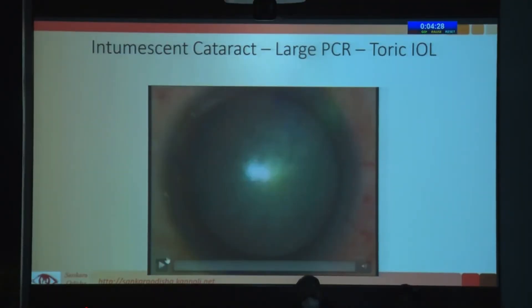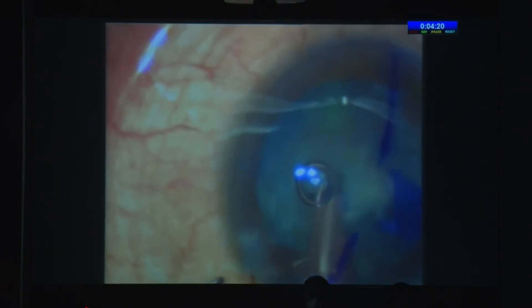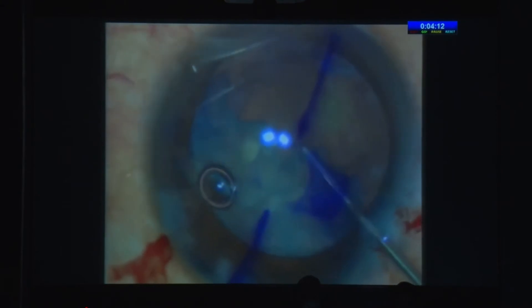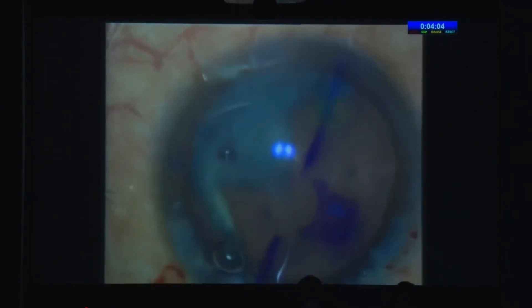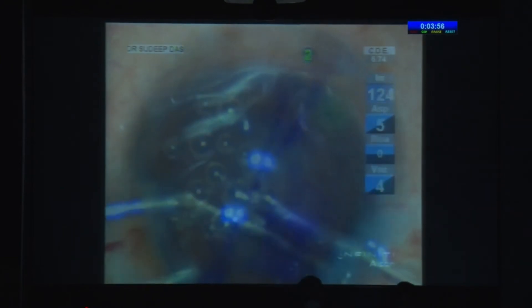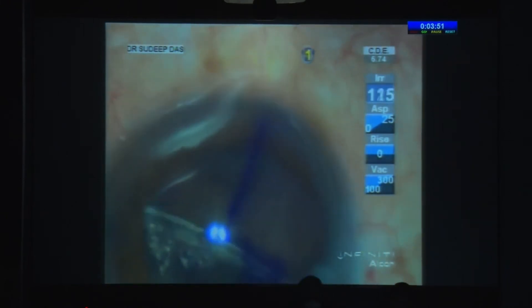This was one of my earlier cases — a very intumescent cataract. The patient was really large, a bull neck, must have weighed about 120–130 kilos, so there was a lot of pressure during surgery. I hadn't injected viscoelastic when I came out — this is not something I would do at all now — and because of that, the vitreous did come to the front. It was a very soft cataract with almost no nucleus, so I could just aspirate out the rest of the nucleus.